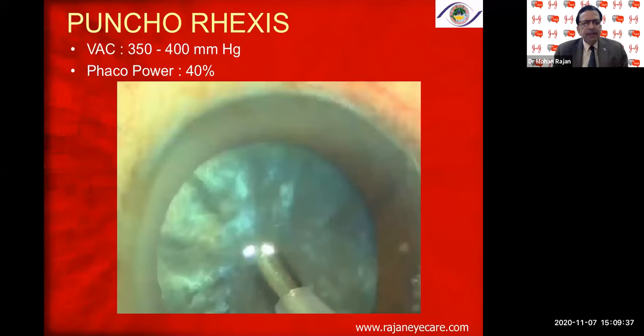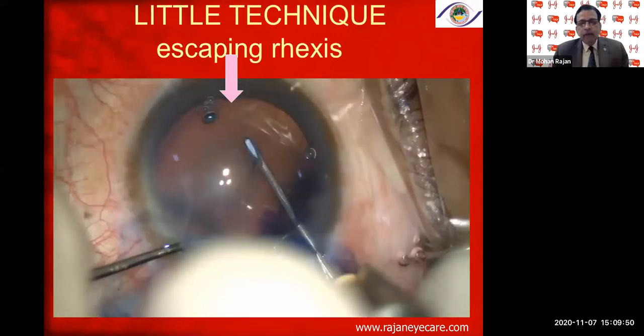I normally do that, but making sure, because we have a hard brown cataract, if you don't use proper techniques, there's a possibility the cornea can become white. And that is the reason why I always say, especially for beginners, to convert.